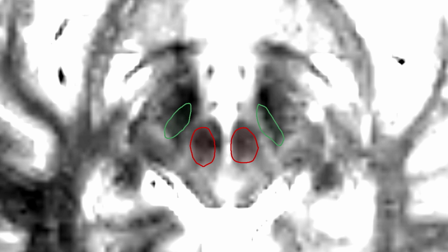An example is when the electrode is placed somewhat medially of the STN according to the model, but when looking at the MRI it is clear that the electrode is actually in the STN, albeit at its medial border. In such a case, the VTA would be planned in the same manner regardless of whether the electrode is inside or just outside of it. With that said, I strongly advise that the model is controlled by someone who can interpret the MRI images. If you ignore this, then at least this should be done if the patient is not responding to the stimulation as expected.